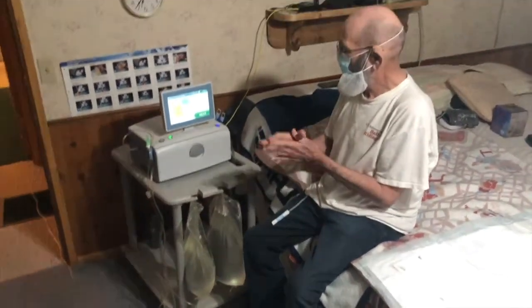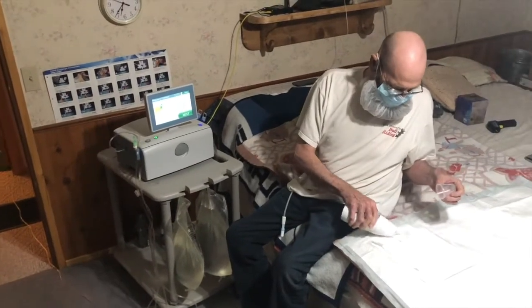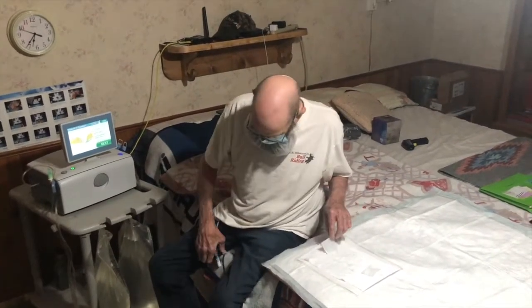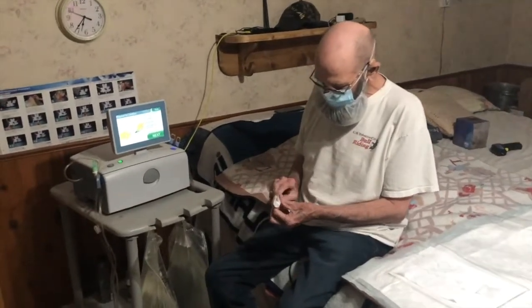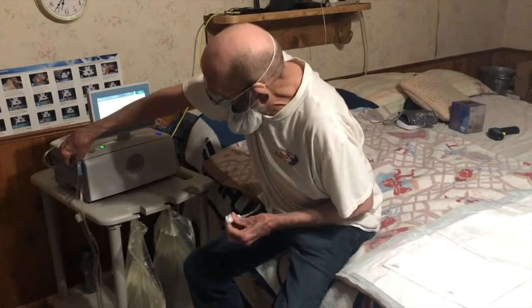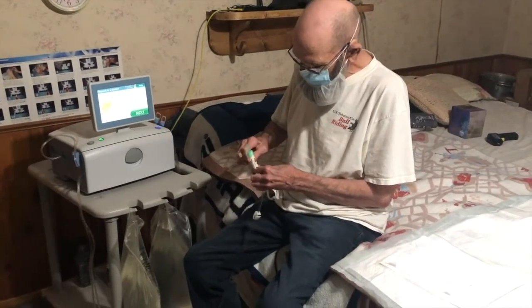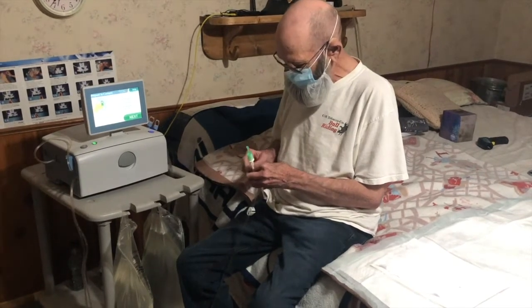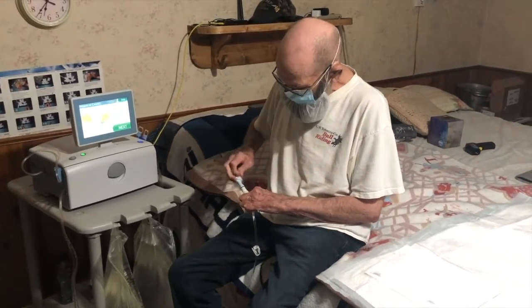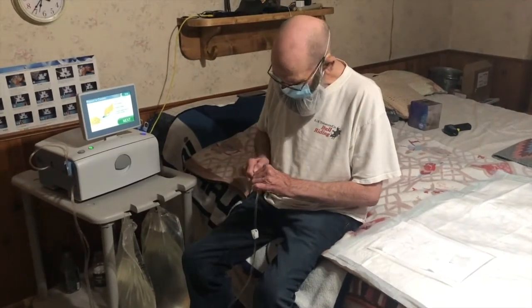Put on mask and disinfect hands. Then connect the patient line to the transfer set. Then I get me some bleach. This is bleach that I use for cleaning all my stuff. Then you clean this little thing right here, that little hootis. You get that good and clean. This is where my lifeline hooks up. Make sure you don't get anything contaminated there. Tighten that up.